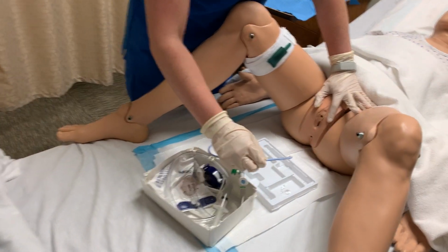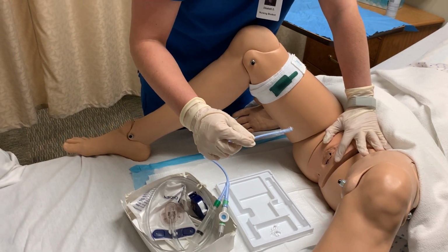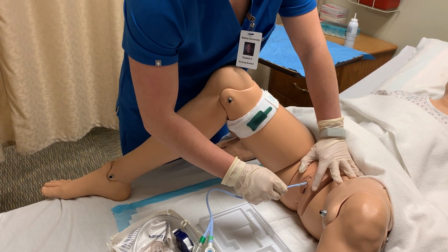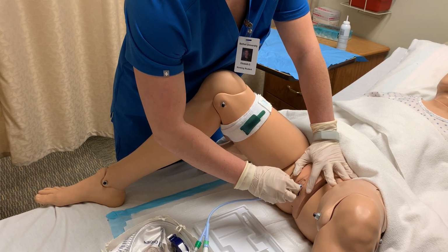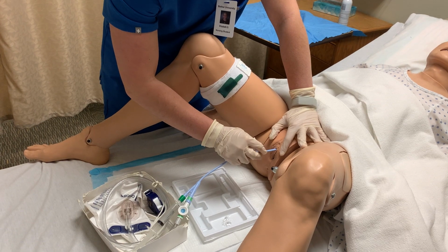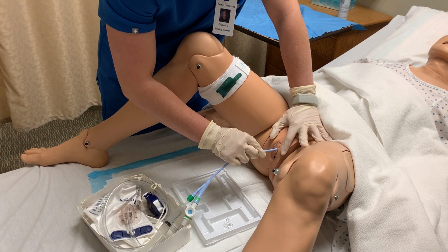All right, Alexa, now I'm going to have you take a deep breath and bear down for me like you're going to have a bowel movement, okay? Okay. 1, 2, 3. I'm going to go ahead and advance the tubing until I see a flash of urine, and then an additional 2 to 3 inches.